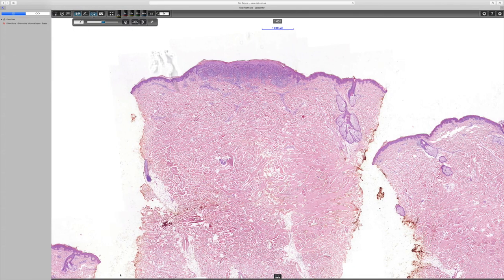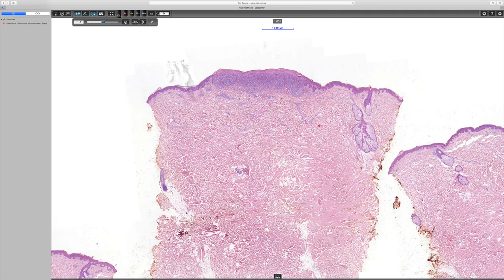This is a very nice case that was kindly shared with me by Dr. Antonina Kalmakova of CSD Healthcare in Kyiv. I don't have clinical history other than to say this was a solitary lesion that developed in an adult, and that helps us a lot when we think about the differential diagnosis of such a lesion.